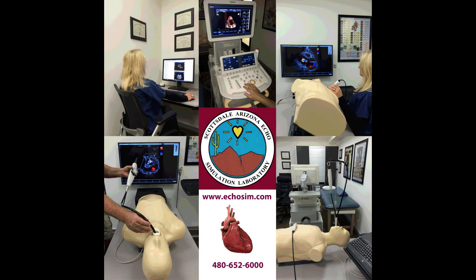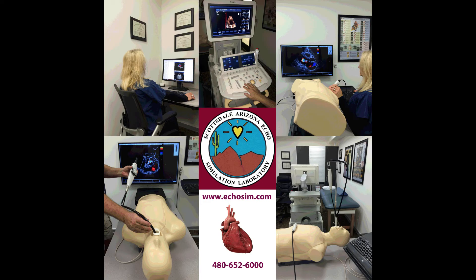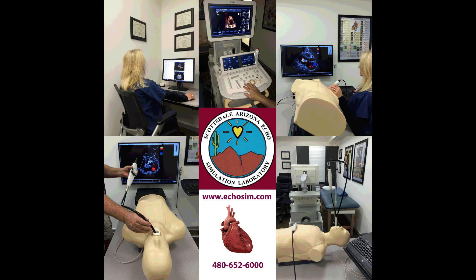A limited five-view transesophageal echocardiography exam has now been described for use in the emergency department and critical care units during cardiac arrest. Here, using the HeartWorks simulator, we demonstrate one recommended viewing sequence.